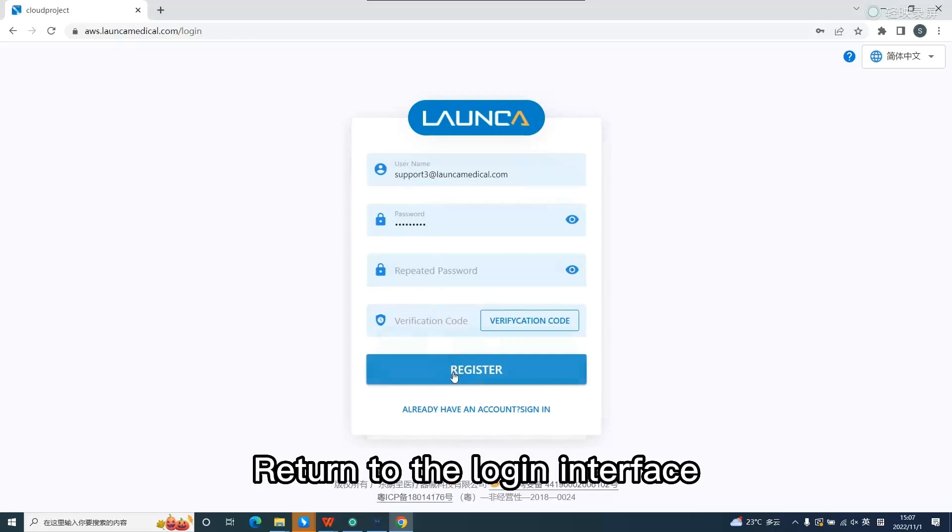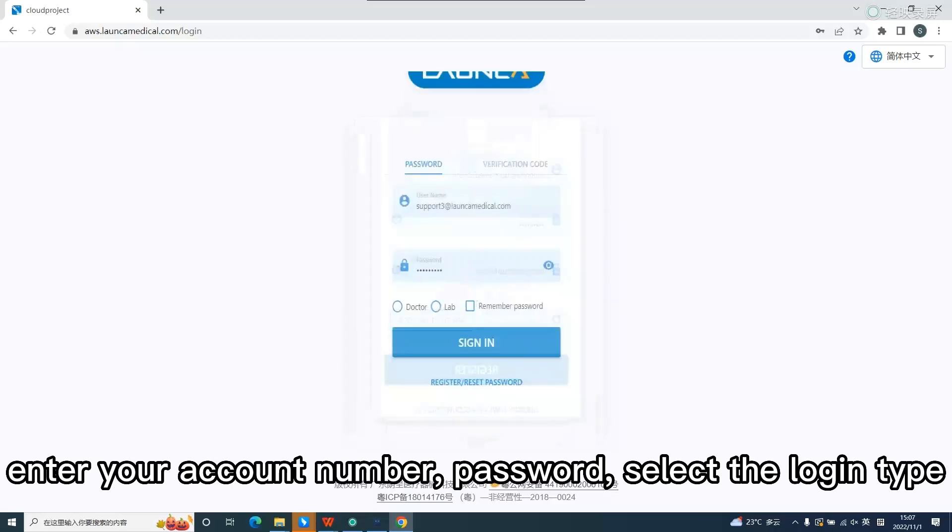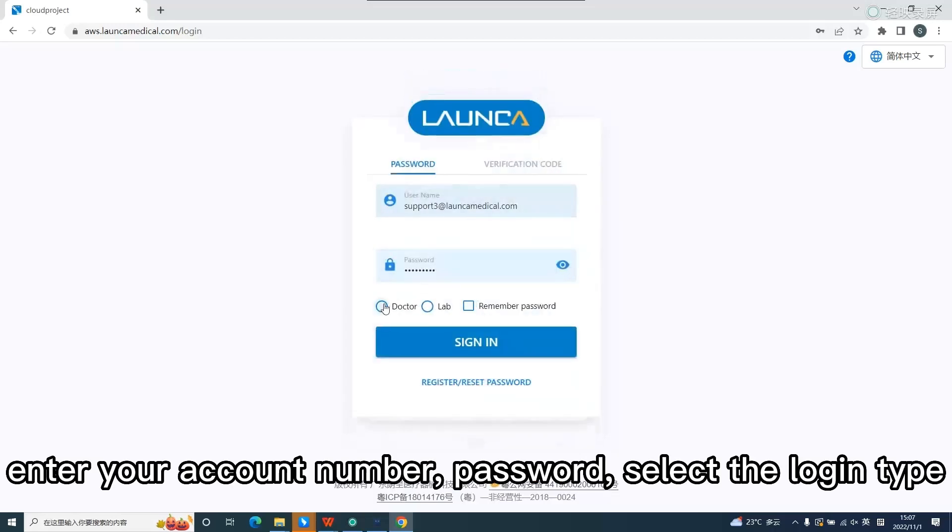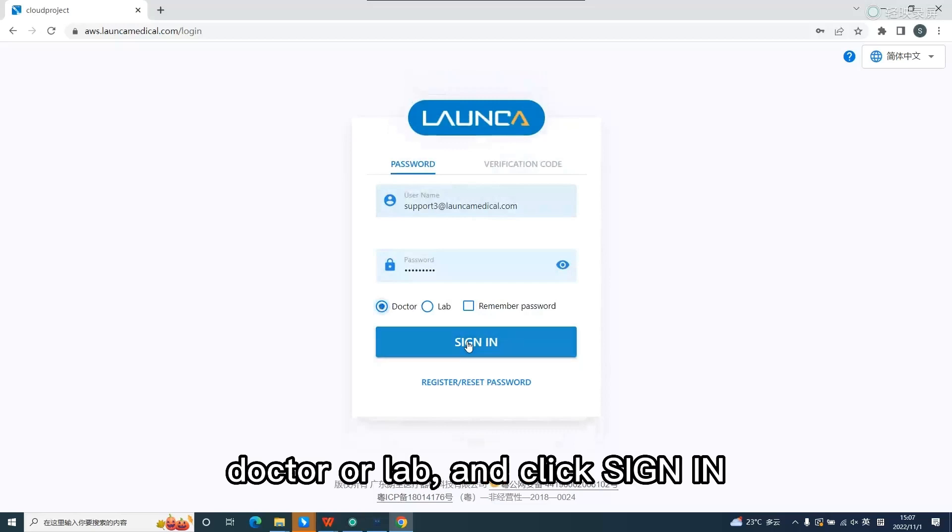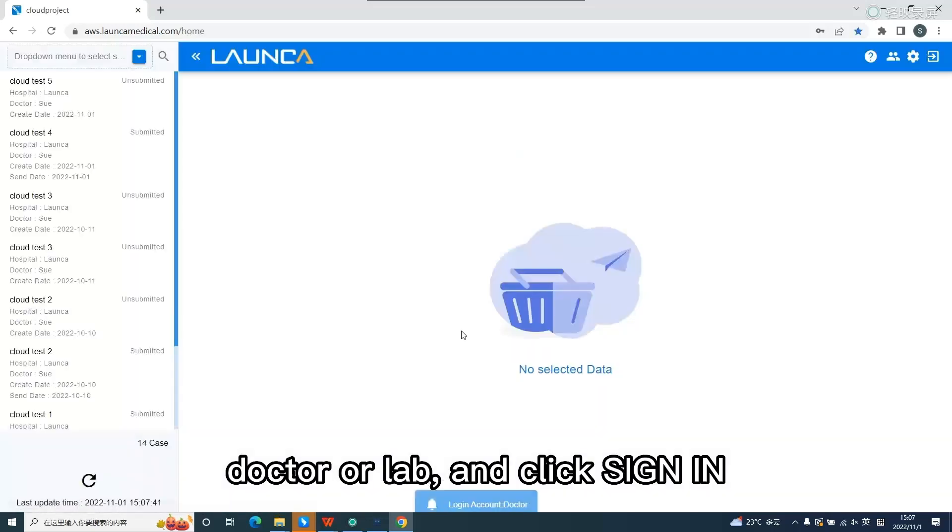Return to the login interface, enter your account number, password, select the login type, doctor or lab, and click sign in.